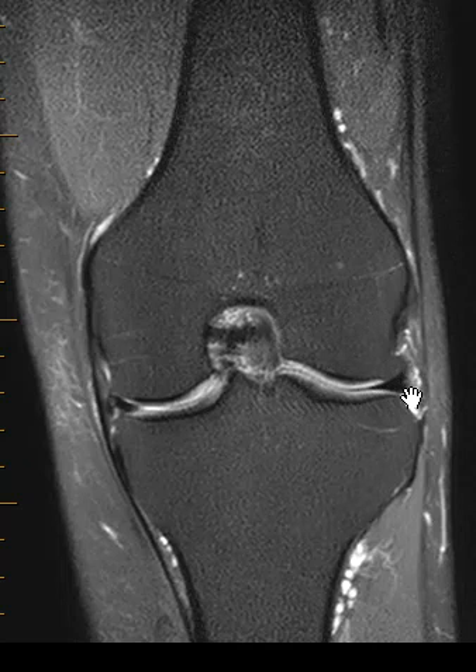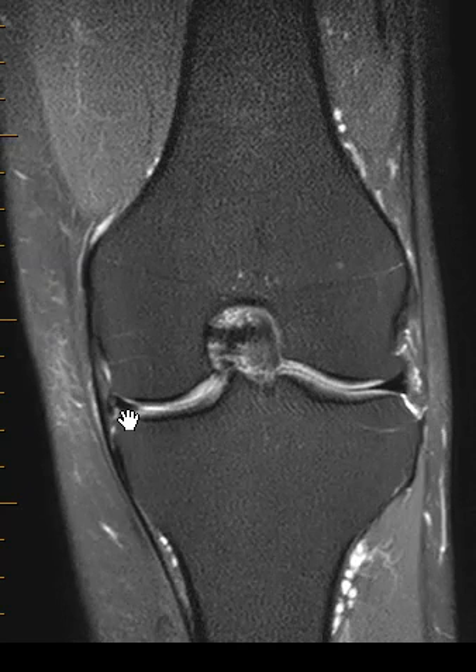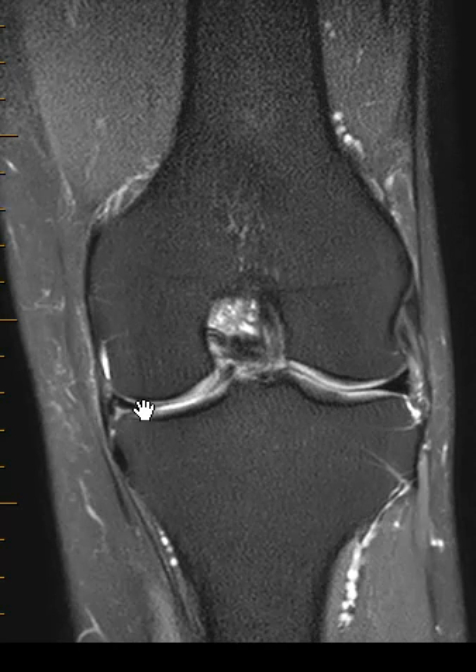The menisci are these little black triangles that fit between the femur, which is rounded, and the flat tibia. This little wedge over here is the lateral meniscus looking normal. On this side we have the medial meniscus. You see how there's a little area of brightness along the undersurface, along the bottom of it. Well, there's a piece of that that is torn and flipped into the inner part of the joint. This little dark band right here is that piece.